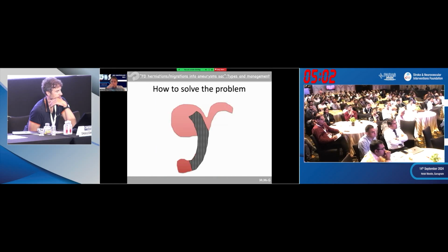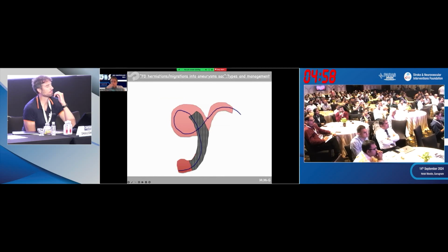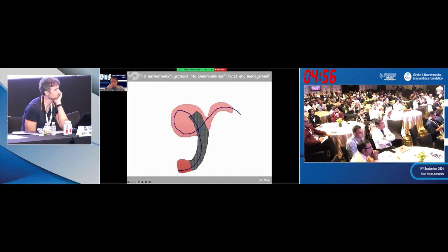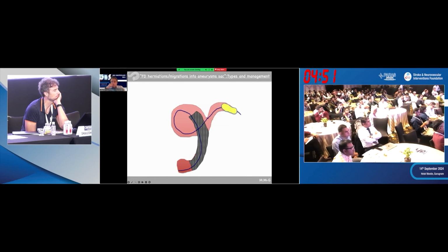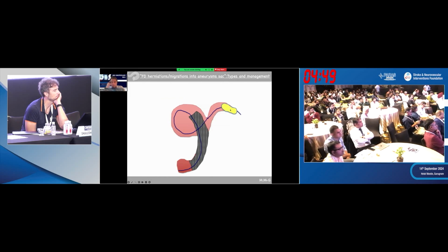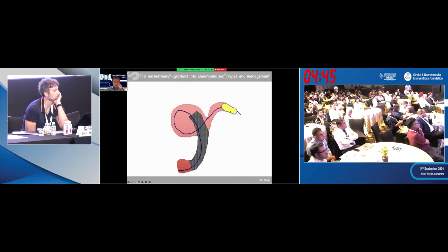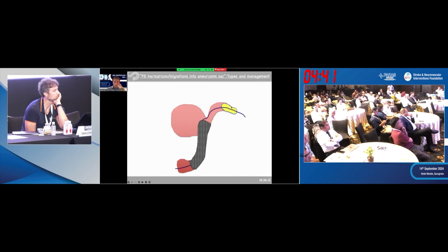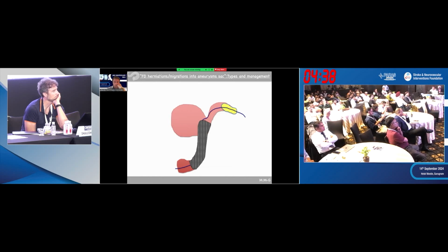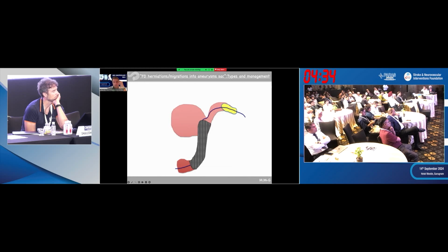So how to solve this? Easy. You navigate through the stent. You have the proximal end open, so you just go through, get a lumen inside, and achieve a distal position. My recommendation is to do it with a double lumen balloon. Then you inflate the balloon, and keeping the balloon inflated, you pull back the wire. By pulling back the wire, you straighten the system, and you have this flow diverter already at the neck.